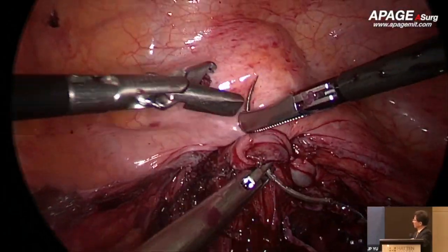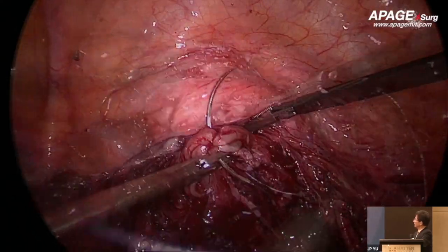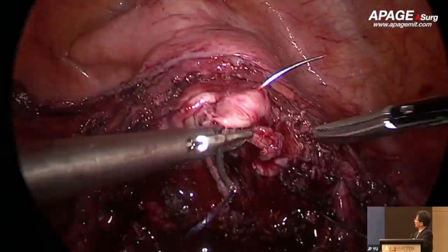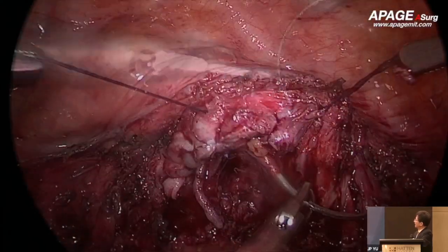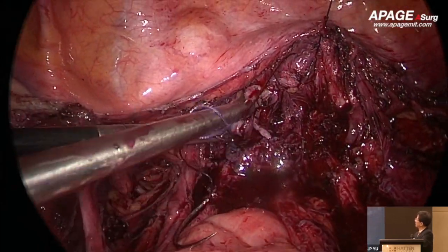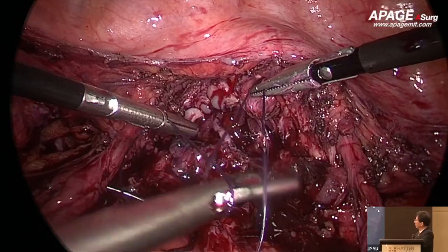We got the cul-de-sac obliteration. Doing the procedure just as regular, I think that would be better. Then we will not have the same mistake as in the LACC study. In the LACC study, because of the non-standardized procedures, they got such a barrier in laparoscopic radical surgery. That is the reason they got a very poor outcome for the patients using laparoscopic surgery. So we should have standardization in deep endometriosis surgery. Then I think they will have the same result.